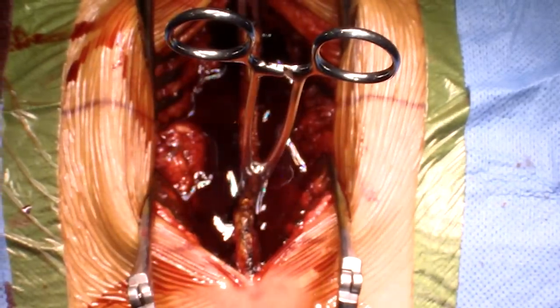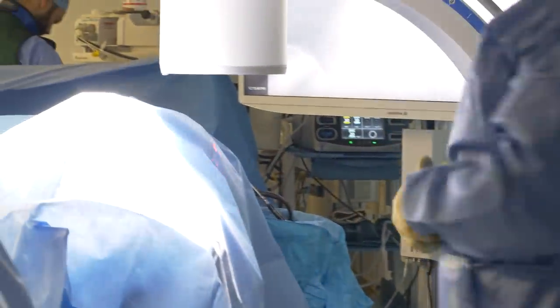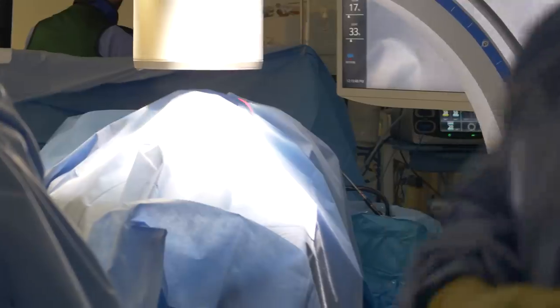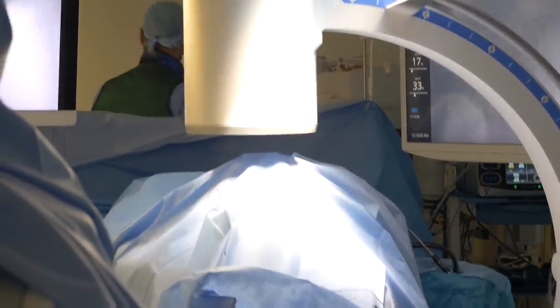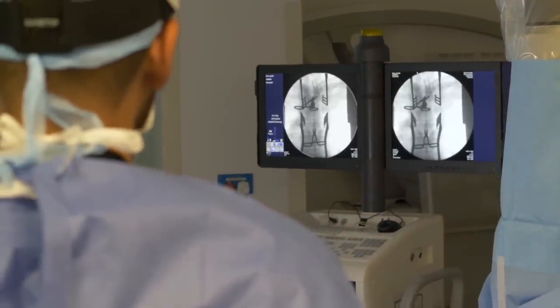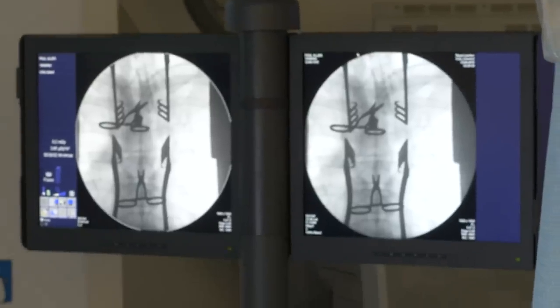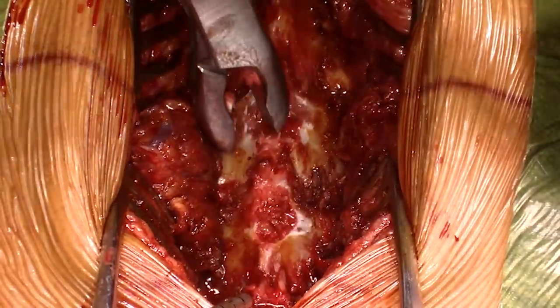We're going to put a metal instrument on these spinous processes and we filled the hole with something called betadine to keep it clean and we'll cover it up and then take an x-ray to see exactly where we are, and this is the x-ray machine coming in now. On that x-ray we can see the bullet lying right in the middle of our operating field so we know that we're going in the right direction.